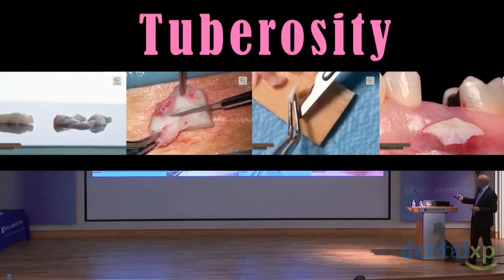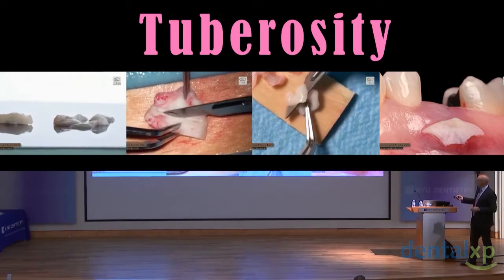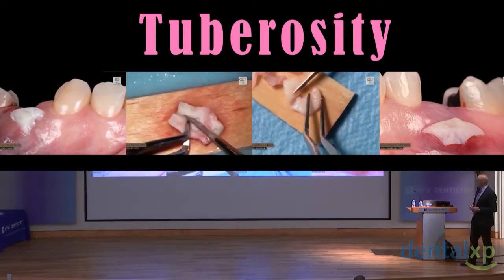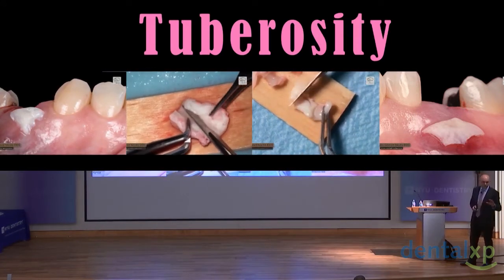But we get a huge quantity of soft tissues from that tuberosity. Sometimes, only sometimes.